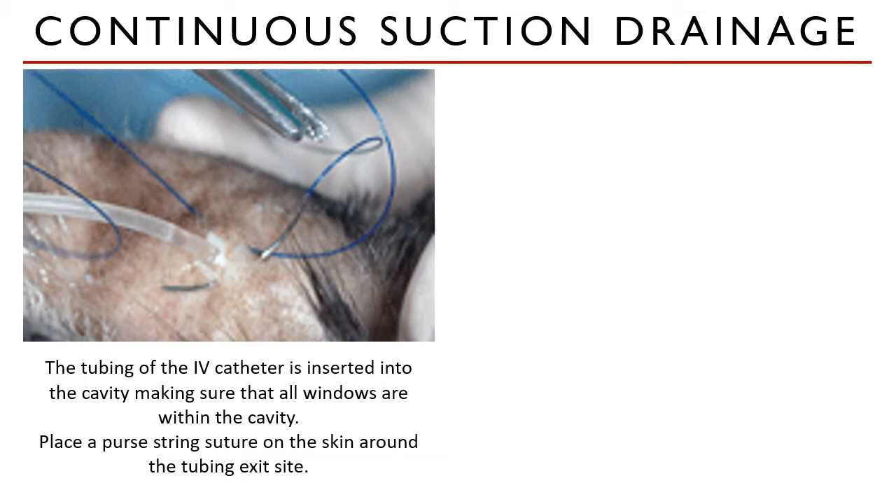The cut tubing of the butterfly catheter is inserted into the cavity through the stab incision. Make sure that all the windows are placed within the cavity to facilitate drainage. To secure the tubing, place a purse string suture around the skin and the tubing to create a negative pressure.